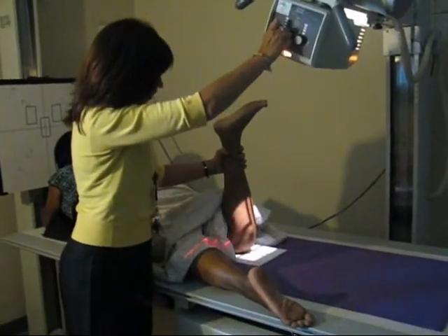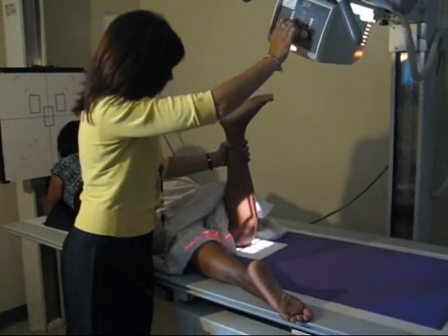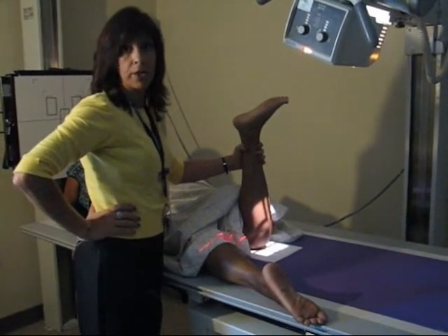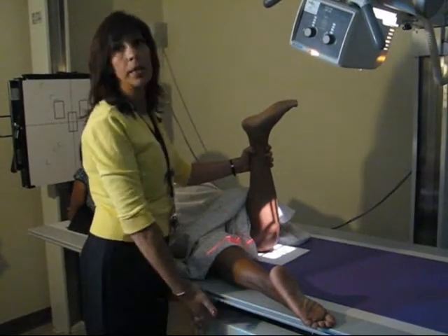Again, this projection can be done tabletop. We've already determined that her knee is small enough. If she had a knee bigger than 12 centimeters, the cassette would be in the bucky.